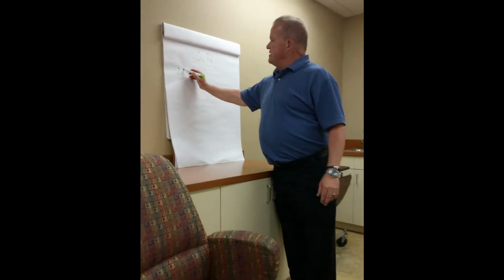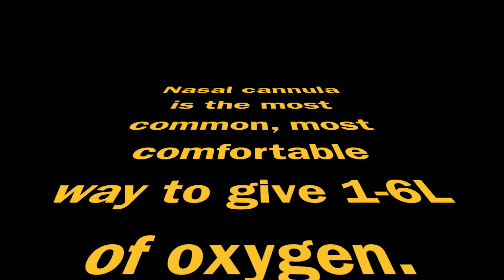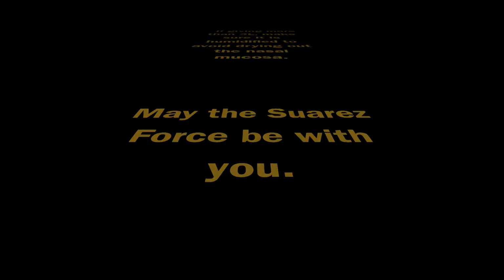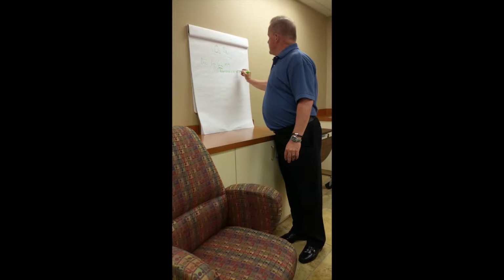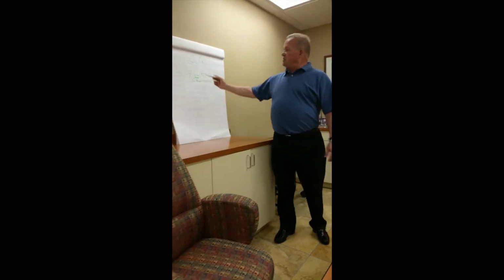Nasal cannula is the most common, most comfortable. It needs humidification so we don't dry out the nasal mucosa and get nasal bleeding, etc. Okay? Now you can go up as high as 6 liters.